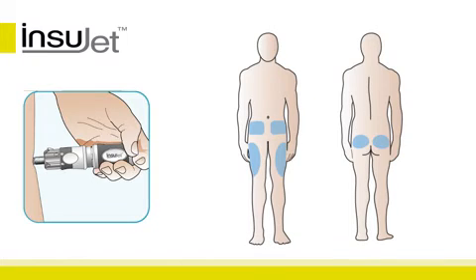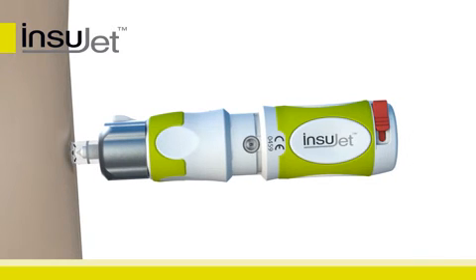Place the Insujet on your chosen administration site. Make sure that the Insujet is placed firmly and perpendicular to the skin. Push the back of the device towards the administration site until you hear a firm click. You won't feel a needle.